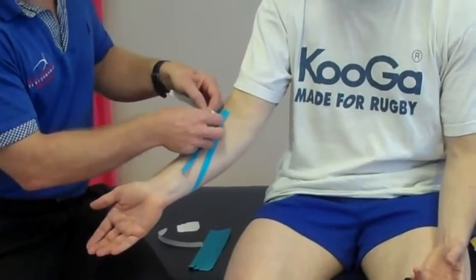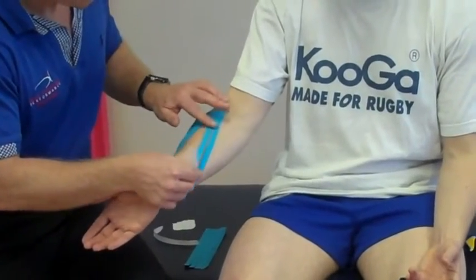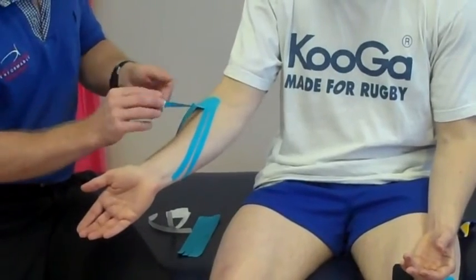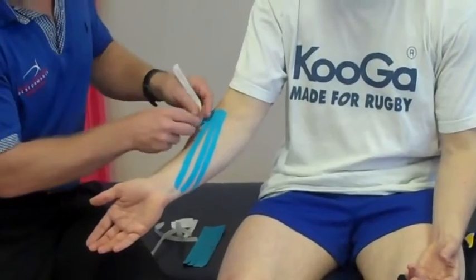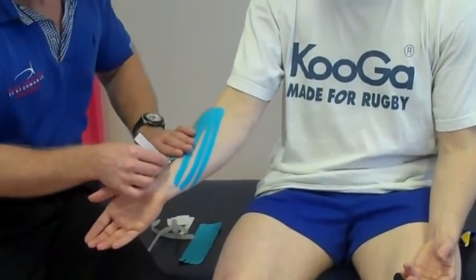Then we can do the same on the second leg, then the third one, then the last one, and just mold that around.